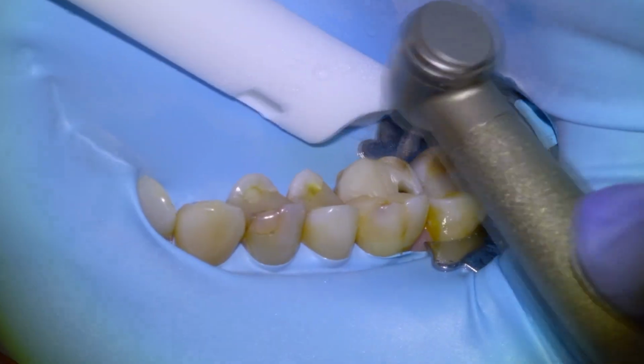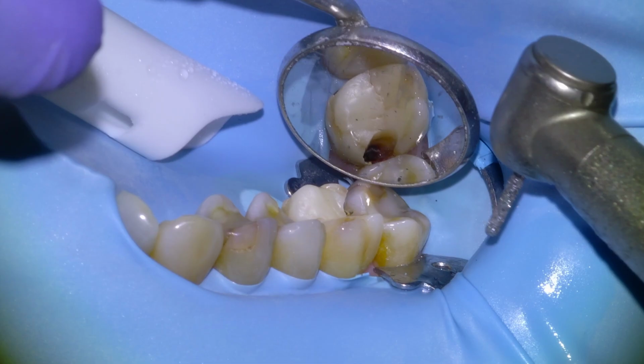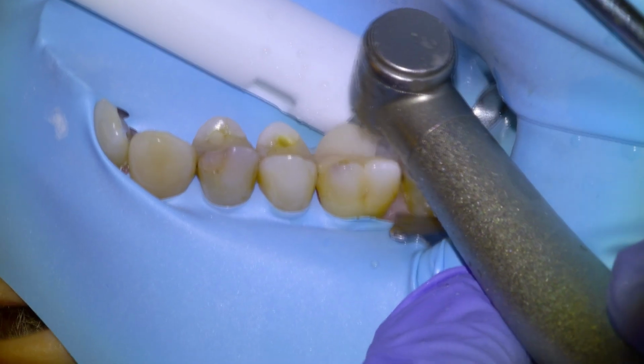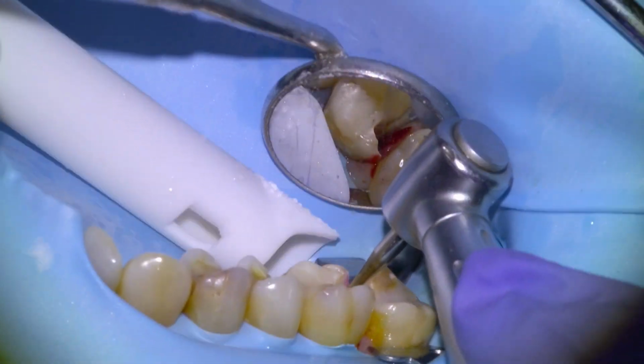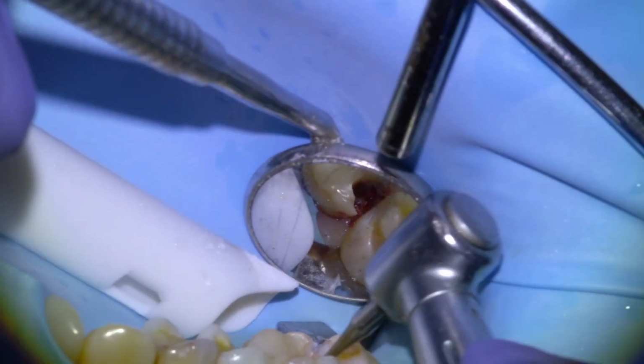So we're going to continue our outline form with our KS1, and we're going to note that most of the lesion is limited to the lingual surface of the tooth, so we're going to open up that aspect a little bit more. And once we have good access, we're going to go in with our small carbide burr on a slow speed handpiece and begin excavating the soft tooth decay.